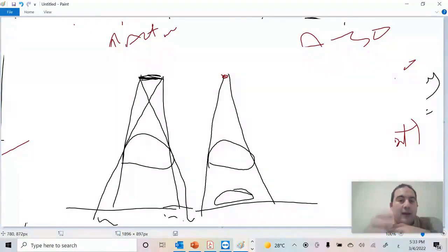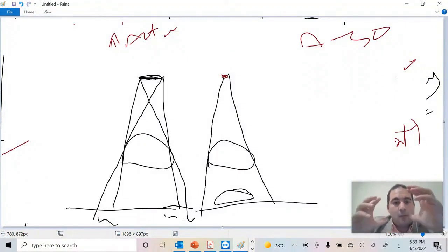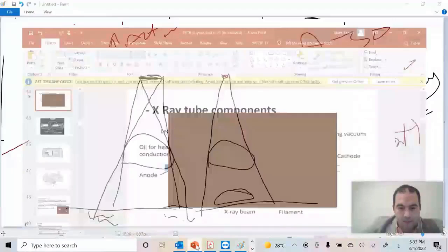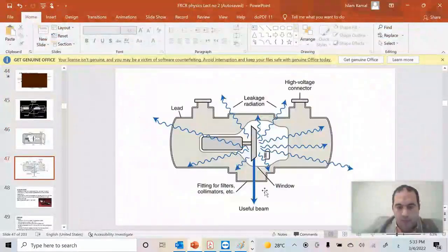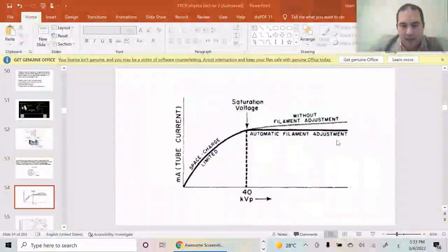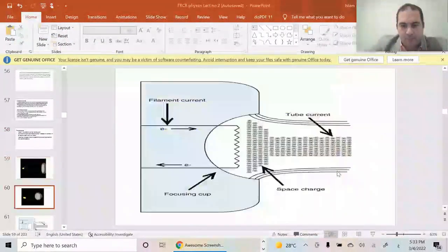It addressed the heating effect or the tube rating, increasing the anode's ability to withstand the heat generated, but it also increased the unsharpness. To clarify this idea for you, I will show you right here. So don't disconnect with me now because this part is very important.